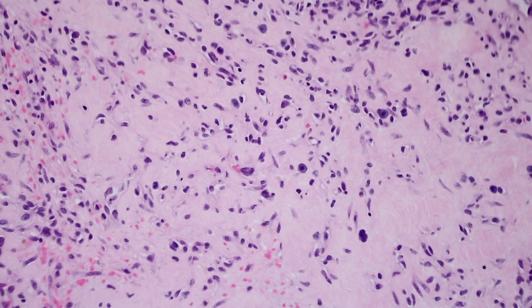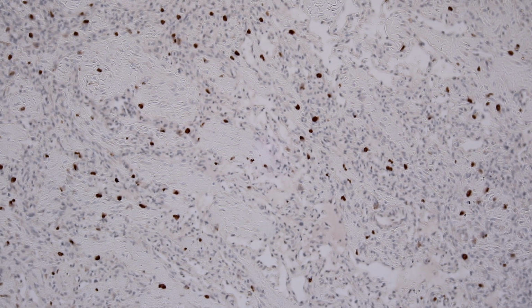The stains I particularly see this phenomenon occur with, most often at least, is pancytokeratin AE1/AE3. And it may happen with other pancytokeratins, but that's the pancytokeratin I use most of the time. And I also see it with desmin, MART1 or MelanA. And myogenin, and particularly with myogenin, it's a problem because myogenin is a nuclear stain that we use to detect rhabdomyosarcoma.